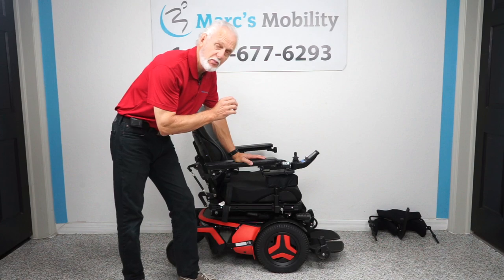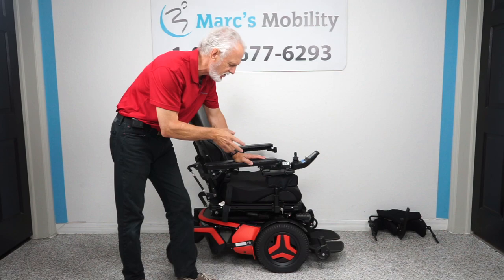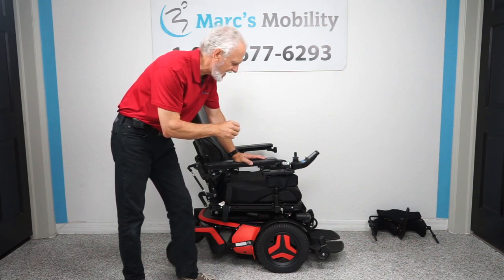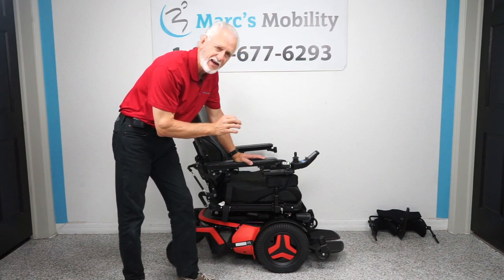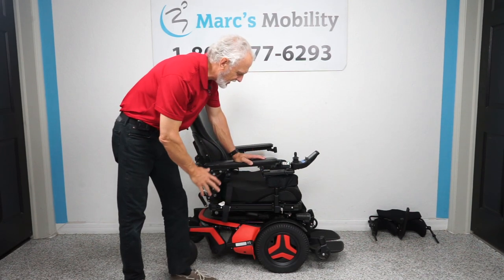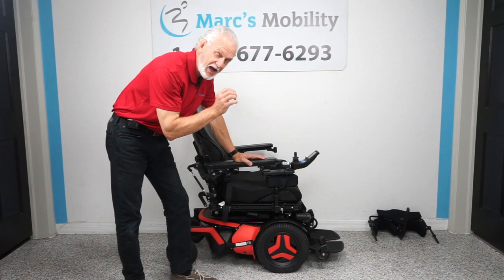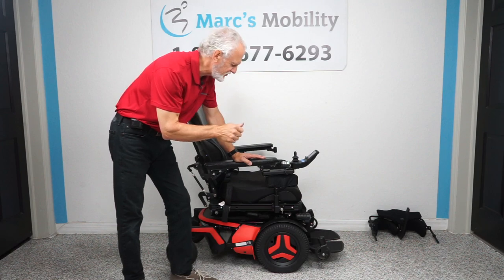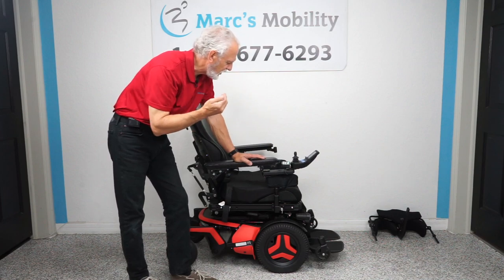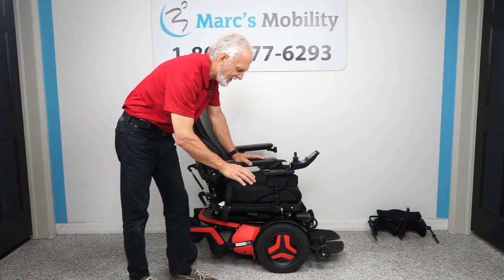We have here a Permobil F5 VS for vertical standing. This chair has seven electrical functions and 27 miles — it's literally brand new, the latest model, with the latest shroud. The color is kind of orangey looking. It has a 14-inch seat lift, electric tilt, electric recline, electric feet that go up and down and in and out, and the standing position.